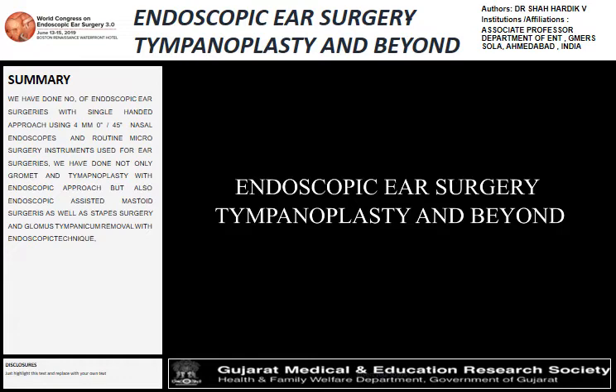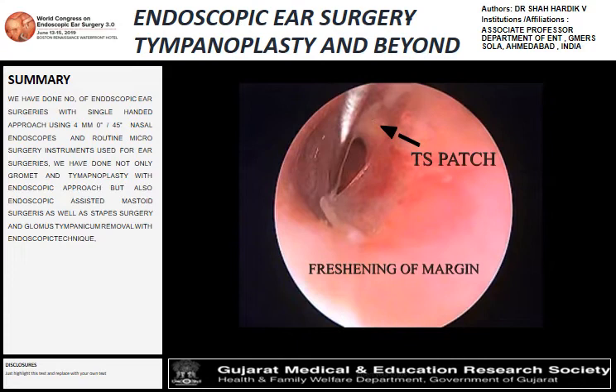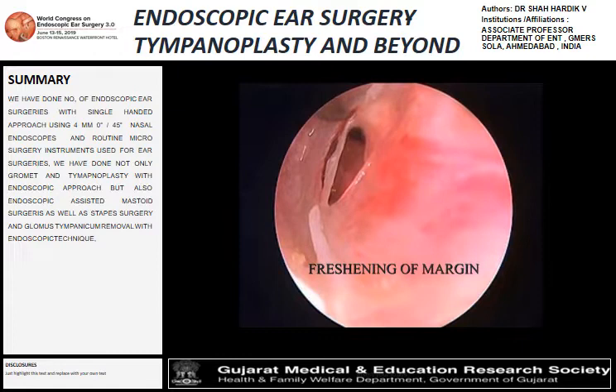We have done lots of endoscopic ear surgery, including tympanoplasty, mastoid, and glomus surgeries with one-handed endoscopic technique. What we are showing right now is a tympanoplasty procedure done with single-handed technique — this is the step-by-step evaluation.